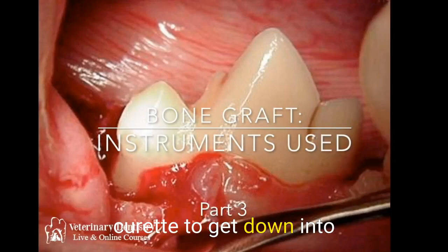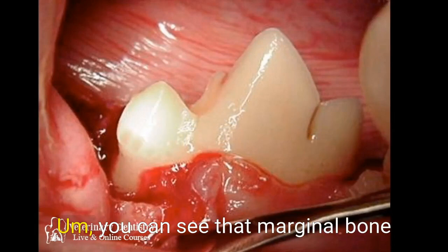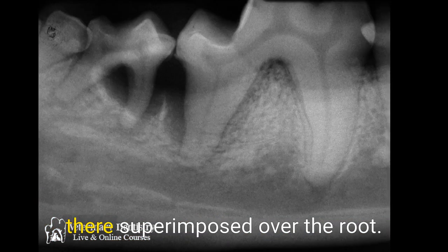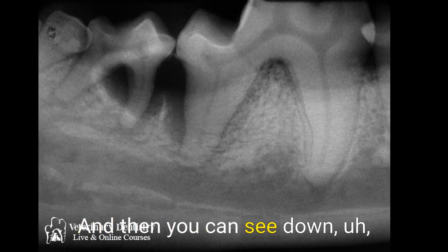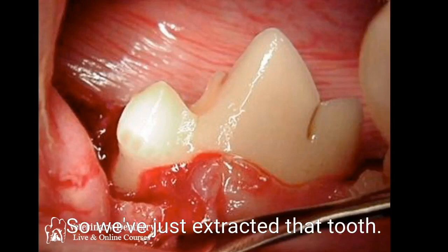Using your periodontal curette to get down into that bone — look at that marginal bone level there, and then you can see it superimposed over the root. You can also see down apical to that marginal bone where we need to clean.